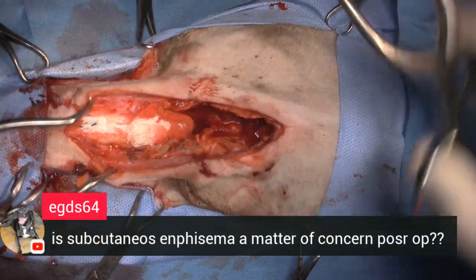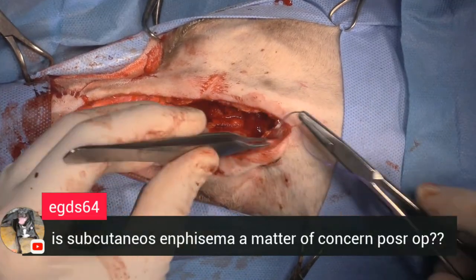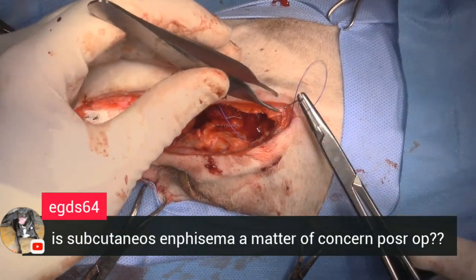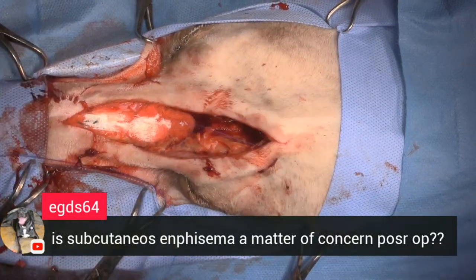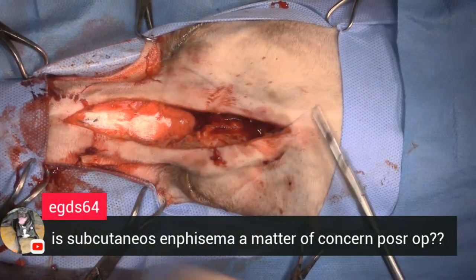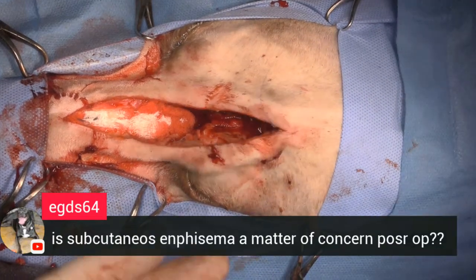So I'm just going to close this up now, and we'll plan on going back in tomorrow and removing that packing. It's called the second look procedure, and they do it all the time in humans, but we as veterinarians are always reluctant not to try to accomplish everything in one surgery, for whatever reason, financial or whatever. I commonly pack things off that are bleeding and come back in the next day. I'd rather do that than have this drip blood all night and then need a blood transfusion that the owners won't let us give. Run that suture for me, please.